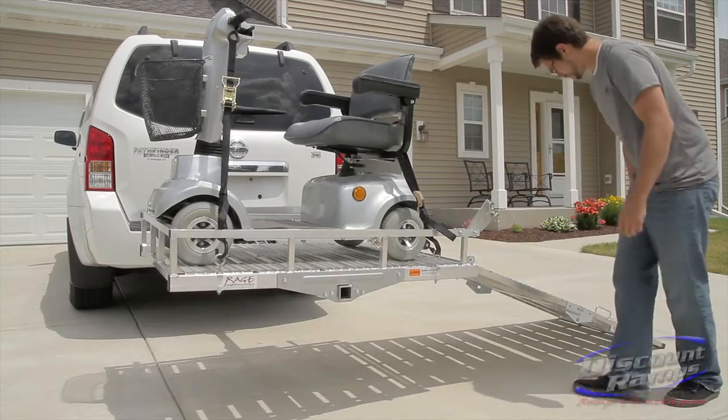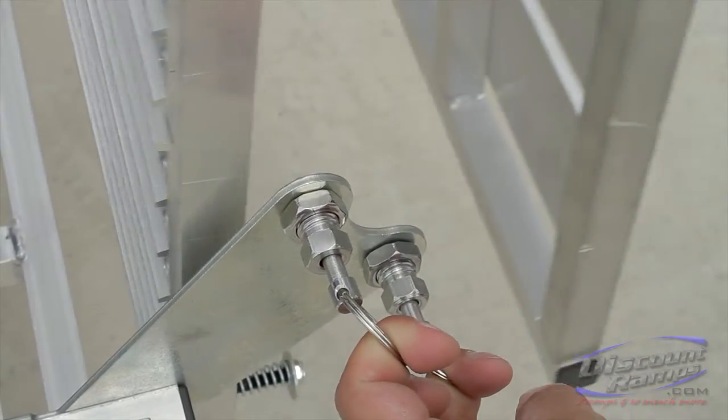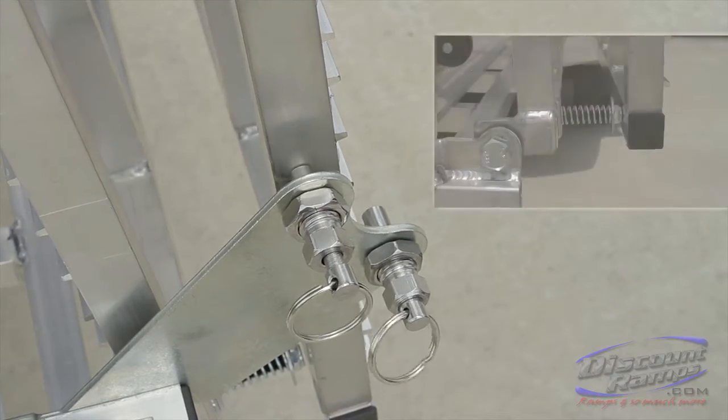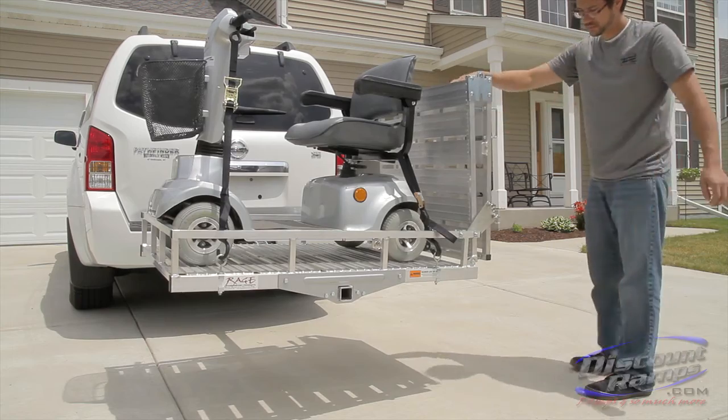To secure the loading ramp in place, pull both ramp storage spring pins and raise the ramp up to its folded position. After the outer folded ramp section passes the outer spring pin, the ramp will be in the upright position. The inner pin will stay compressed. Next, pull the ramp handle towards your body to compress the lower anti-rattle tension springs. The inner ramp storage spring pin will now release, securing the ramp in place.